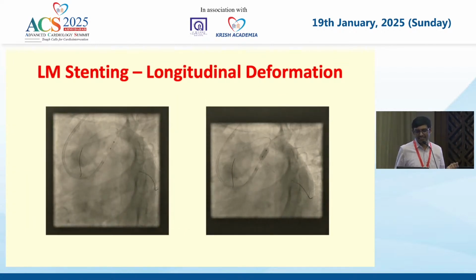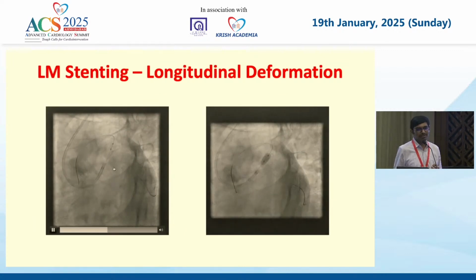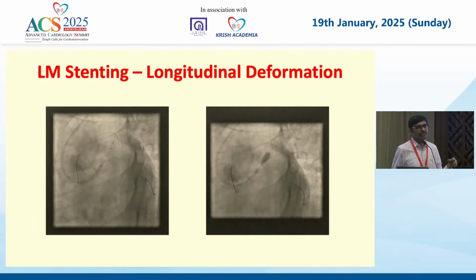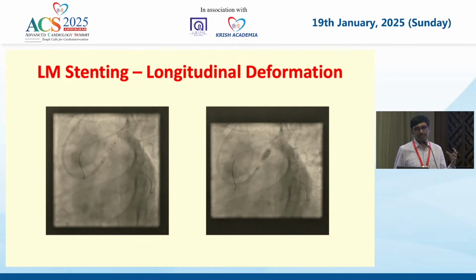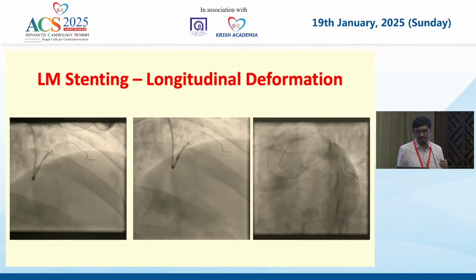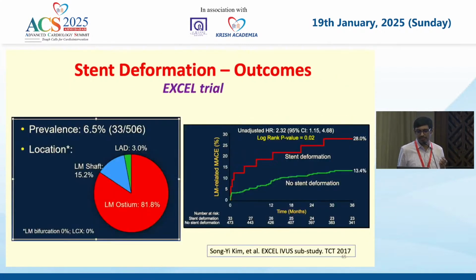Then we did an additional. You just see that fluoroscopically there is absolutely no stent in. So these forms of things can happen. It's very difficult to predict unless you do stent boost imaging. Very difficult to predict angiographically. So further dilatation was done. An additional 5 millimeter stent was implanted.